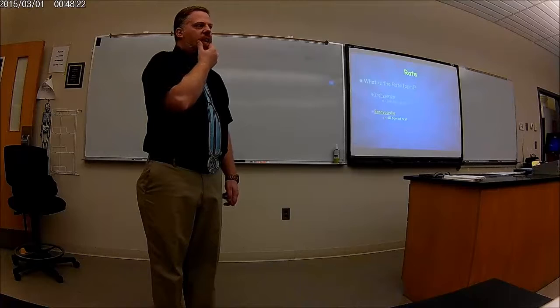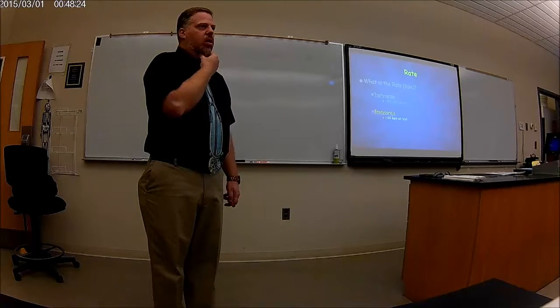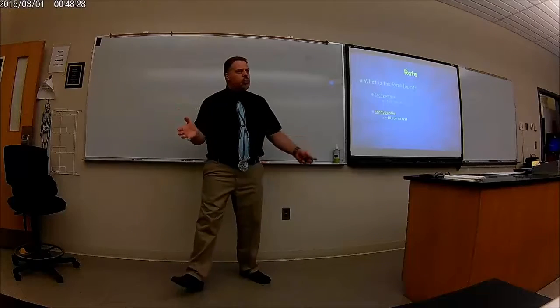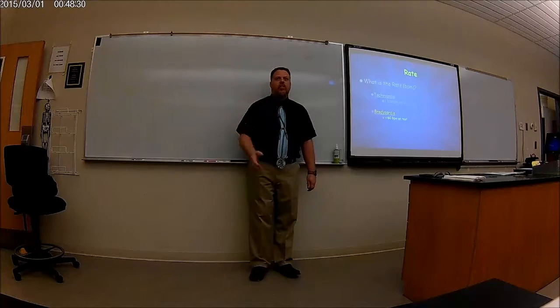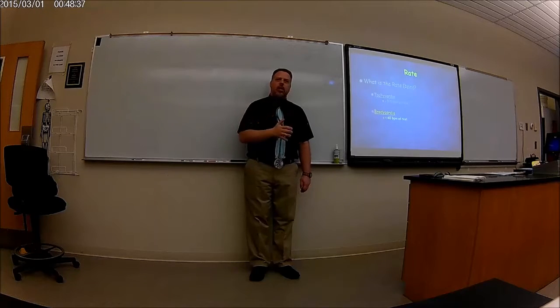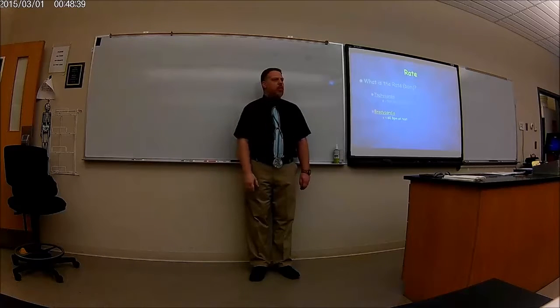Okay? So I might, on a practical exam, give you a strip, what's the number of beats per minute, and tell me if this is normal, is it tachycardia or bradycardia. And you'll be able to do that in 1 minute and a half. That's not bad.